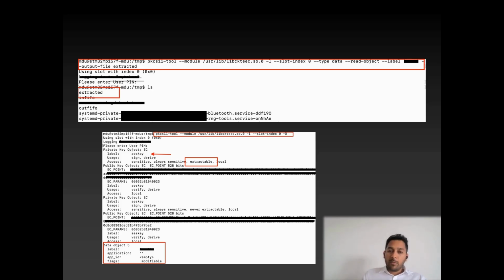You need to carefully design these flags and make sure they are configured properly. As you can see, I'm entering the pin. If you look at the fourth line in the first diagram, I'm entering the user pin. You can brute force it, and I'll talk about that in a bit, about pin misconfiguration. Once you enter the pin, that's it. You are in.